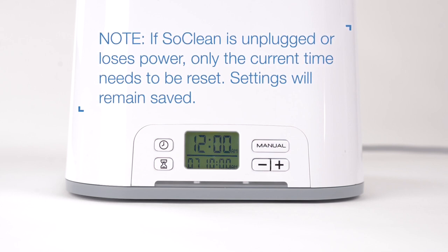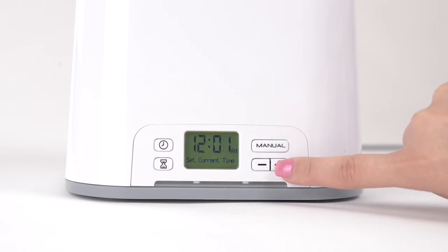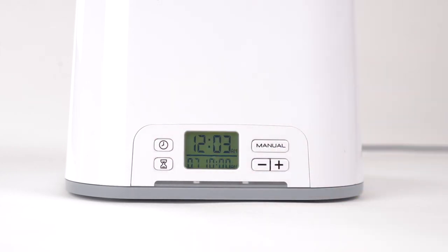The settings will remain saved. To set the clock and current time, press the clock button. Change the time by pushing the plus or minus button until your current time is reached. Then press the clock button once more to store your time and return to the home screen.